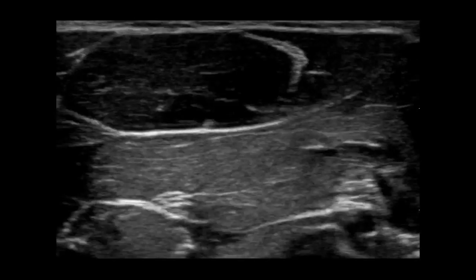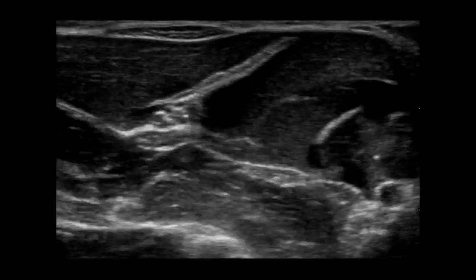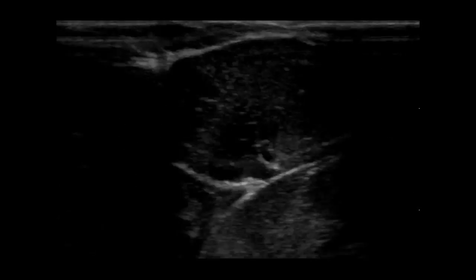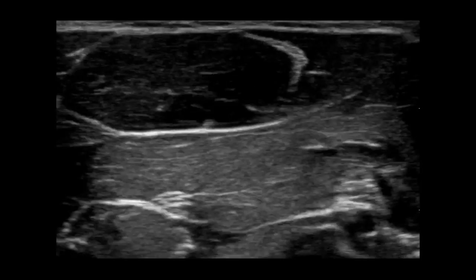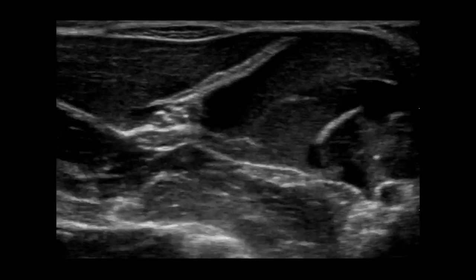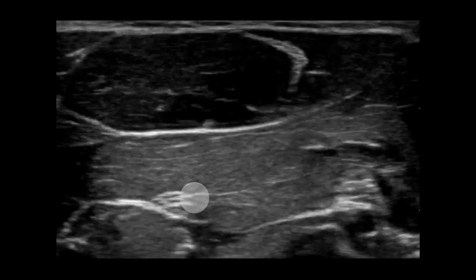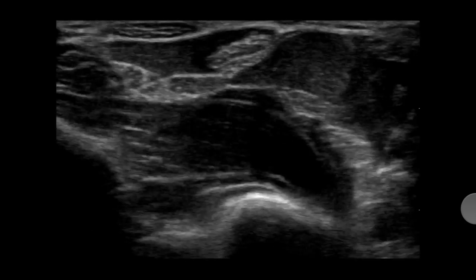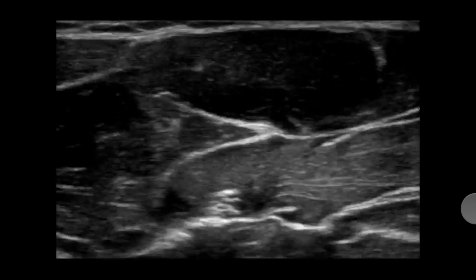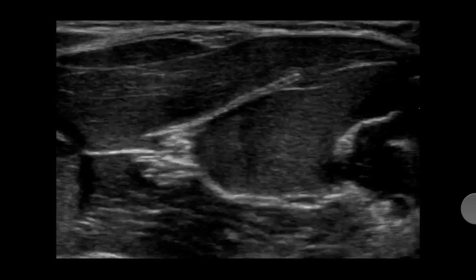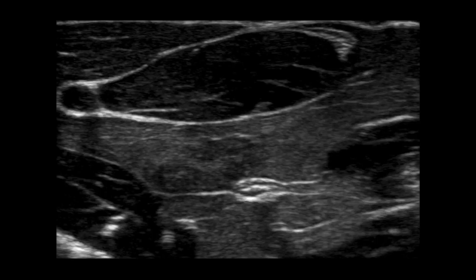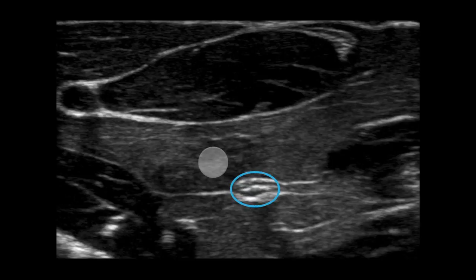Watch as we slide the probe briskly up towards the elbow. Notice how our tendons are becoming muscles — changing in size and caliber. See if you can notice the one thing on the screen that stays static. This is your median nerve. Here is a still image of the median nerve in the proximal forearm. Notice that honeycomb-like appearance and that hyperechogenicity — bright white. Notice the muscle tissues surrounding it, as well as the hyperechoic fascial lines.